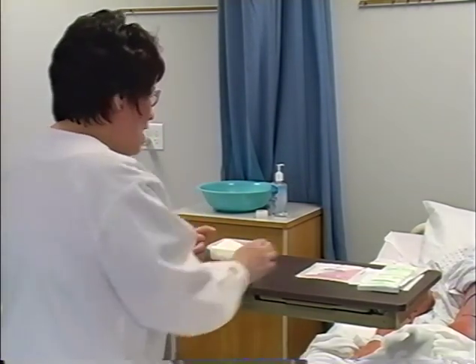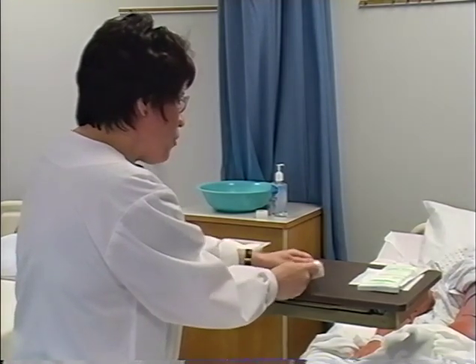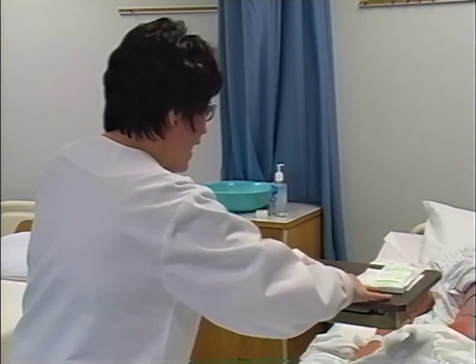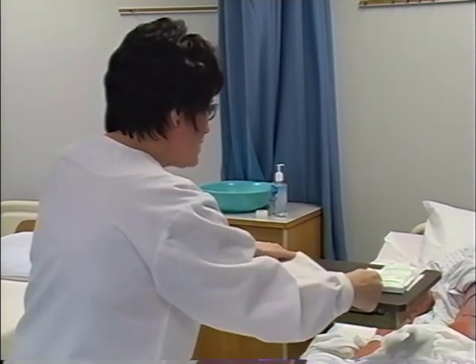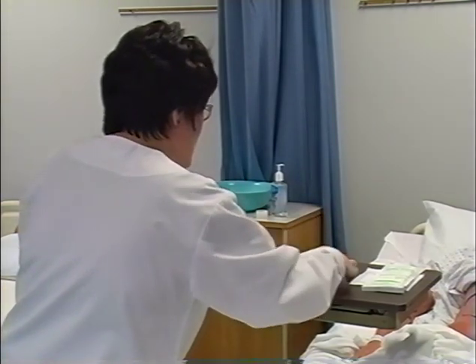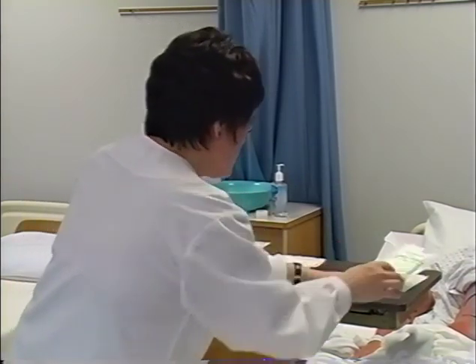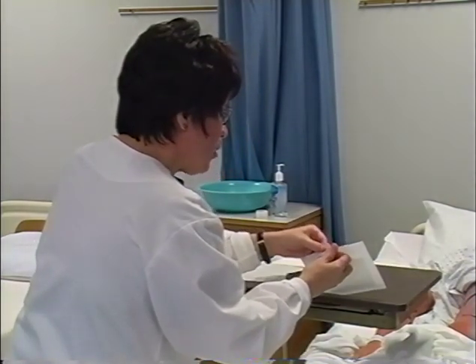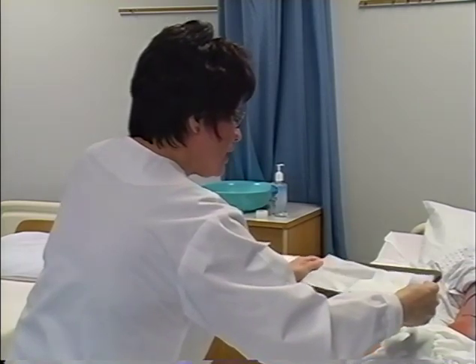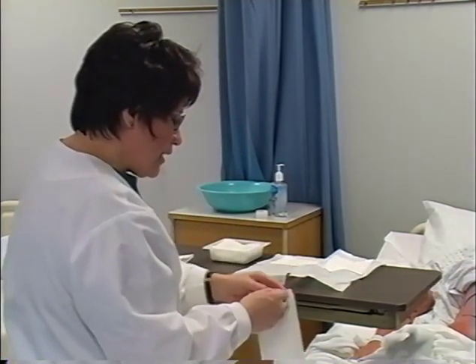I can touch the super sponges by the very edge to line them up. I'm going to check my package of 4x4s — for a novice nurse it's easy to start the package opening — and very carefully peel away at the flap. Once I get my 4x4 open, I'm going to try to slide the gauze closest to the edge of the table facing Mrs. Lewis. If the flap wants to close, I'm just going to open it again, give it another tug, and scoot it to the edge of the table. My drain sponge I'll open next, being careful it doesn't come over the glue line of the package, and I'll slide it right up there. My last package is going to be the abdominal dressing.